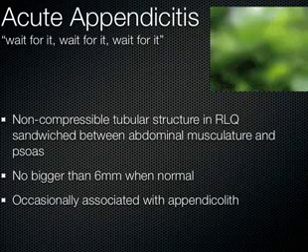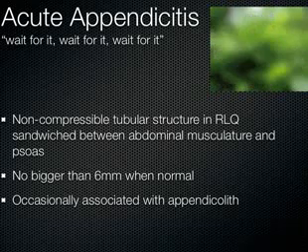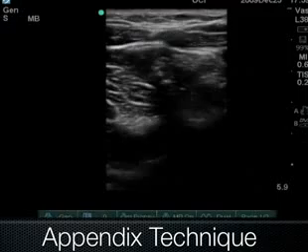You wait for it, wait for it, wait for it, and then all of a sudden you should see the appendix eventually pop its head out at you, and then as fast as you can see it, it's gone again because you moved past the area. Then you go, oh, wait, back up, and you go back, and you're compressing, and then all of a sudden, whoop, it pops its head at you, and then you can freeze the image and show that to somebody. It's kind of what we're seeing here.